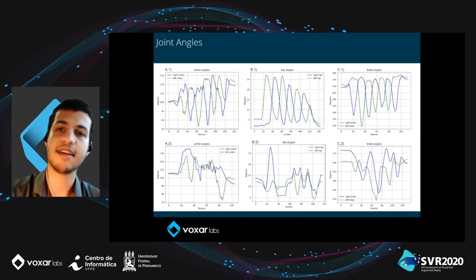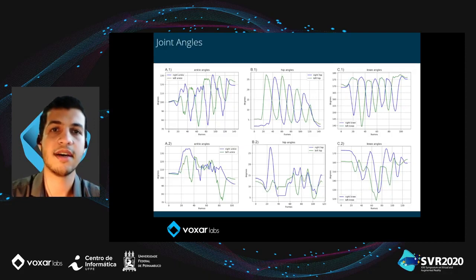When measuring the joint angles, only the hips and the knees showed acceptable results, and since the sensor does not recognize the feet well, it presented the worst outcomes. Some examples of angles for each joint during the gait are shown in these graphics, and a moving average filter was applied to facilitate the visualization of the joint's behavior.